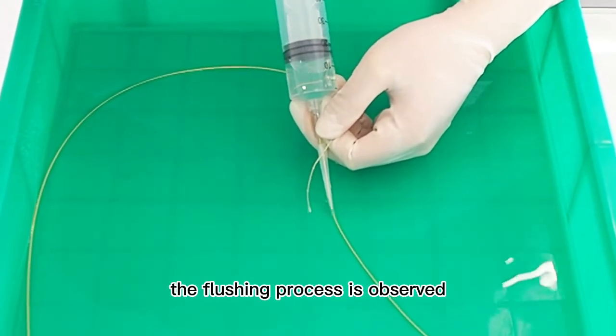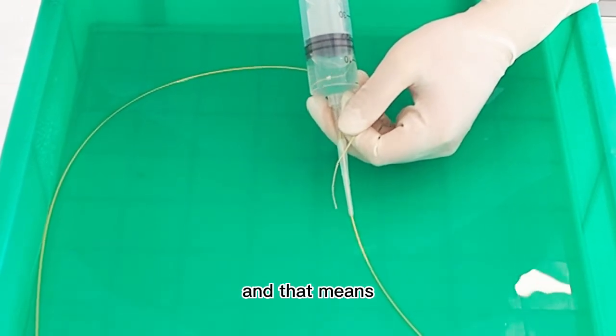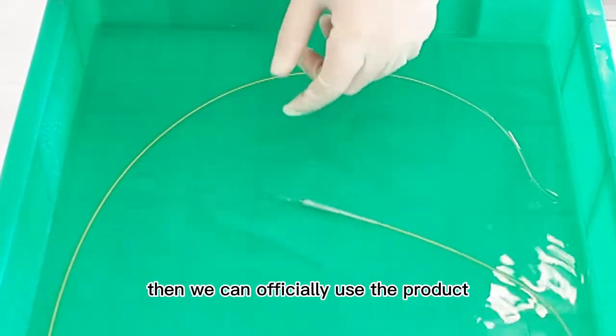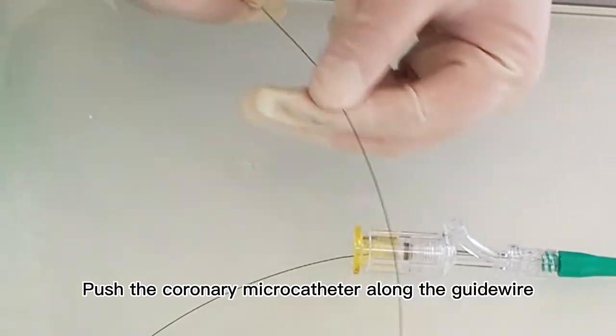The flushing process is observed, and when water is continuously coming out of the head end, that means the air in the coronary microcatheter has been discharged and we can officially use the product. Push the coronary microcatheter along the guide wire.